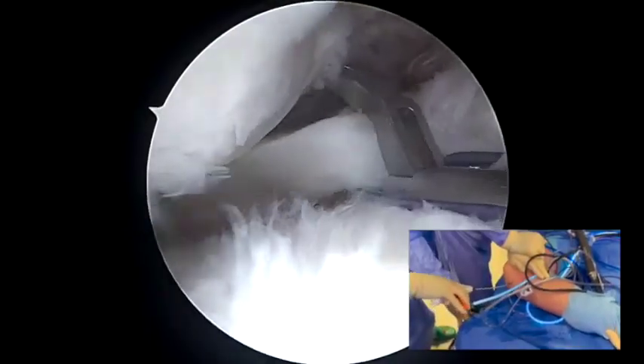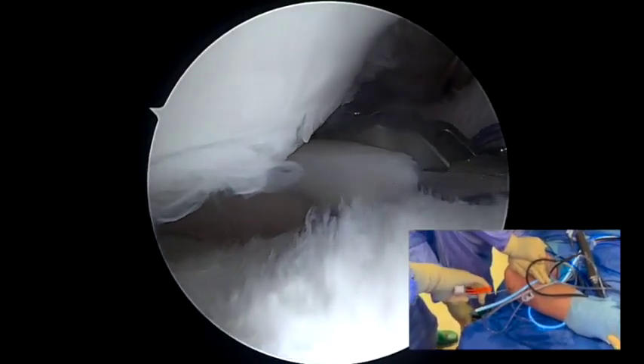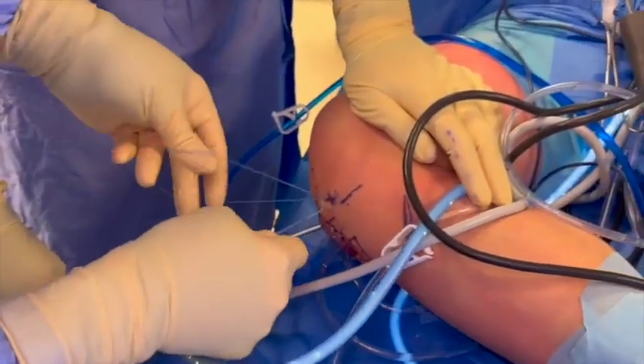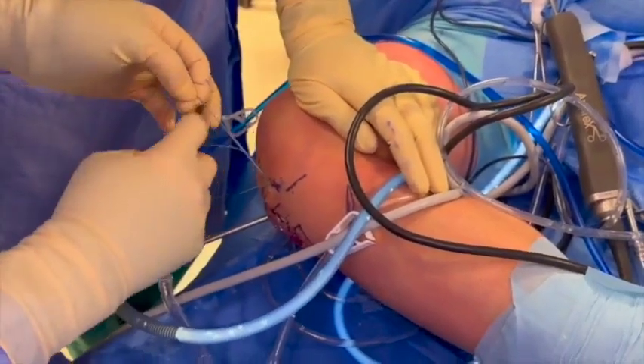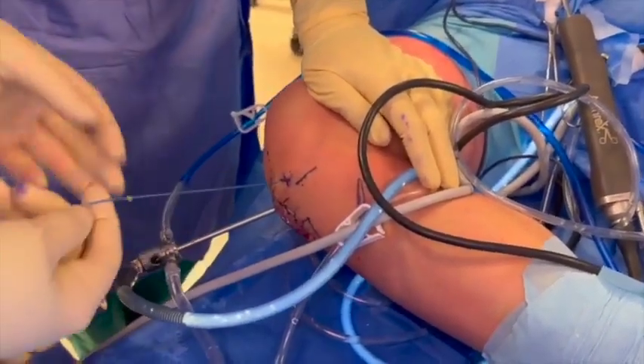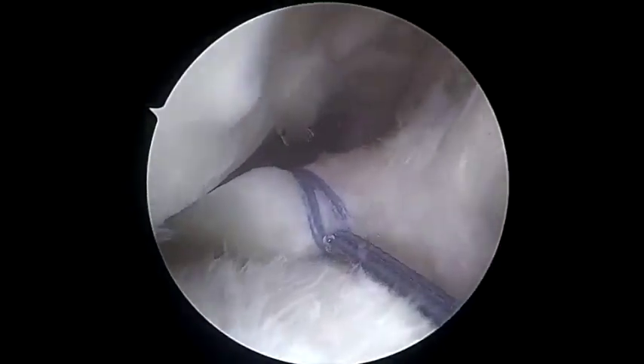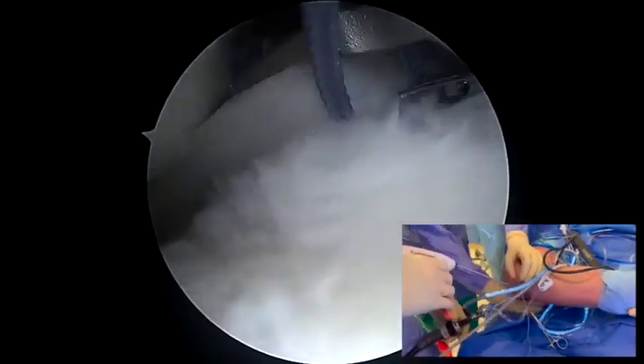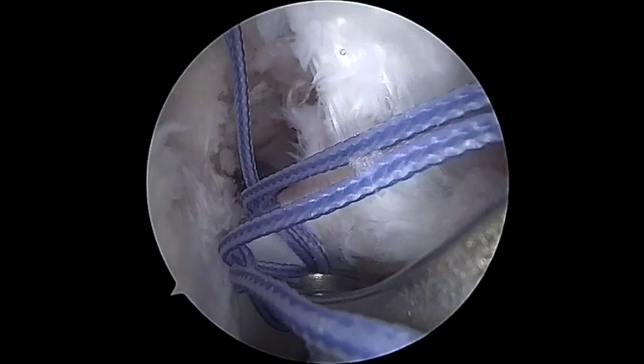The suture for the posterior root is performed using a suture passing device into the joint from the anteromedial portal, loaded with a number 2 fiber wire suture. The first suture is placed and the two free ends of the suture are passed into its loop in order to create a cinch configuration stitch. A second suture is applied using the same technique laterally to the previous suture.